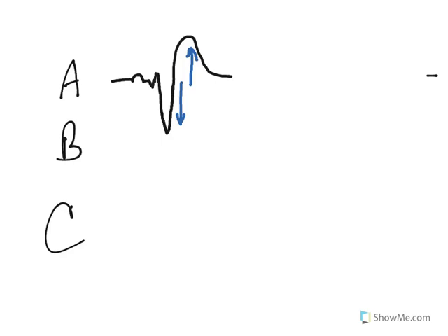That is normal. We call that, I'm going to pause because I'm hoping some of you are saying it at home, discordance, right? We call that discordance, and we expect to see that. That's actually a good thing. What we don't like to see is concordance. Now, I'm going to try to draw this. I'm not going to be good at it, but I'm going to try.